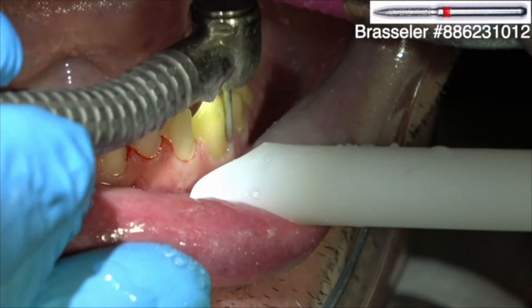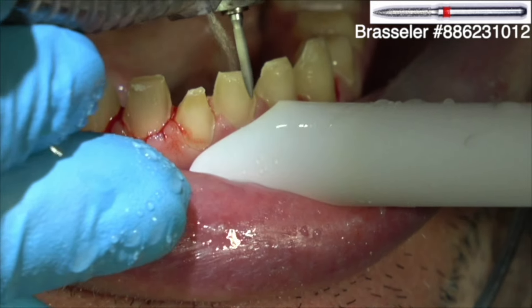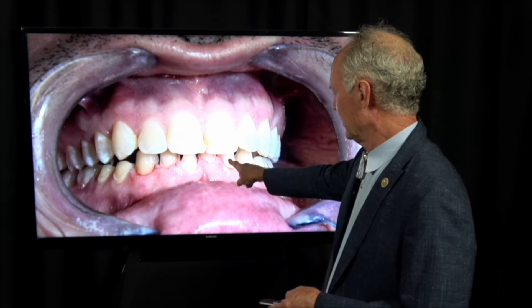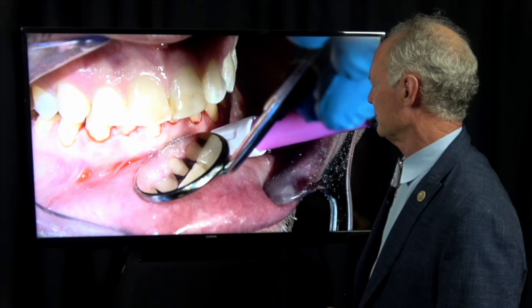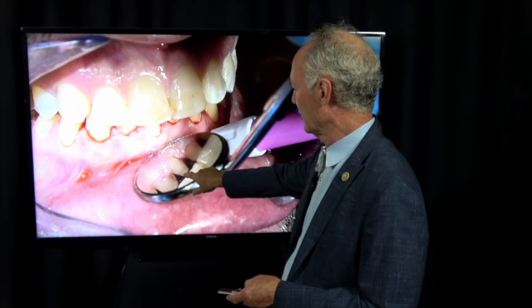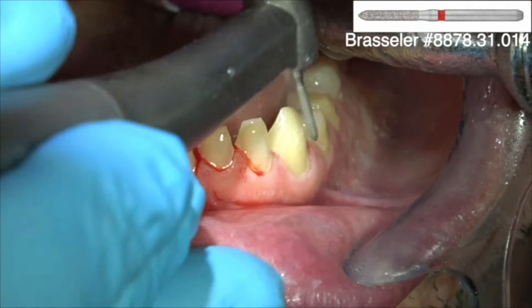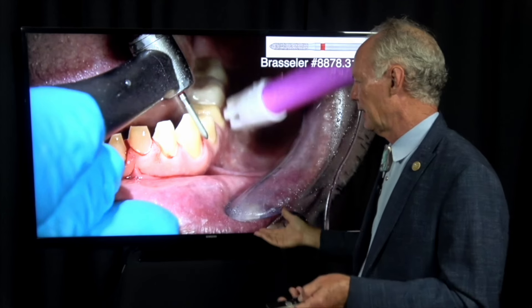I want to reduce at least 2 millimeters — I want at least 2 millimeters of clearance incisally when I'm prepping lower anterior teeth. The lower anterior teeth occlude normally with the palatal of the upper anterior teeth. Have the patient close together and look with a mirror to be sure there's enough clearance between the incisal of the lower anterior teeth and the palatal of the upper anterior teeth. The studies show that you can have up to 4 millimeters of cantilevered restoration off lower anterior teeth, but I try to stay with about 2 millimeters.